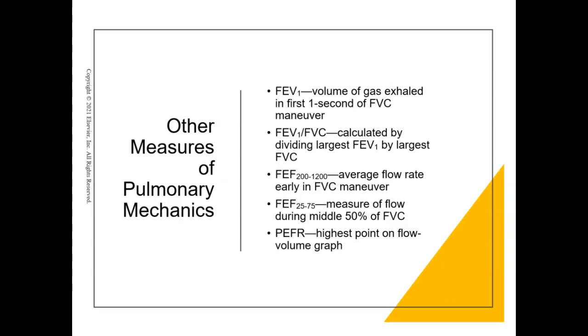Long-acting bronchodilators should be stopped about 12 hours before. And then we also will do pre and post bronchodilator testing with forced vital capacities. When we talk about pre-post bronchodilator testing, that means doing a baseline FVC and then giving a bronchodilator like albuterol and doing another one within like 10-15 minutes.